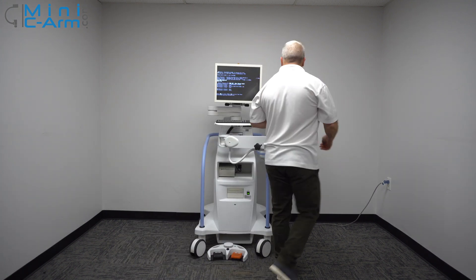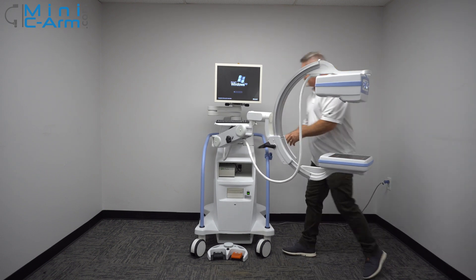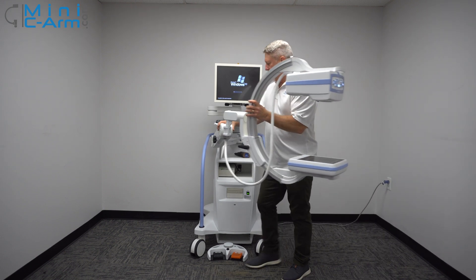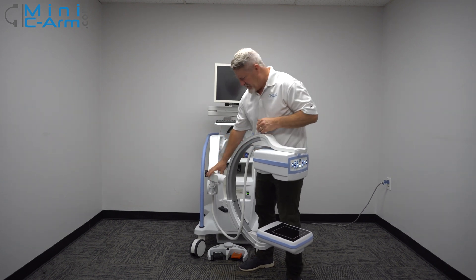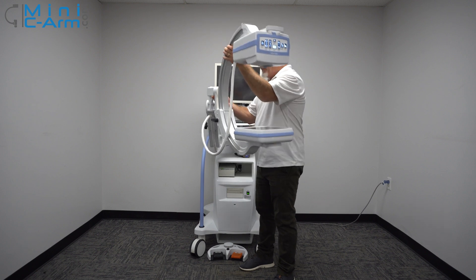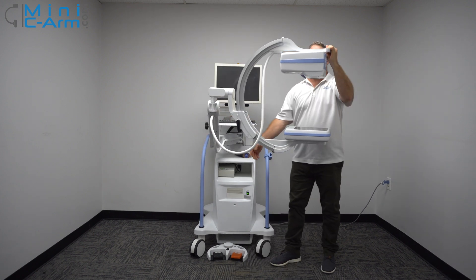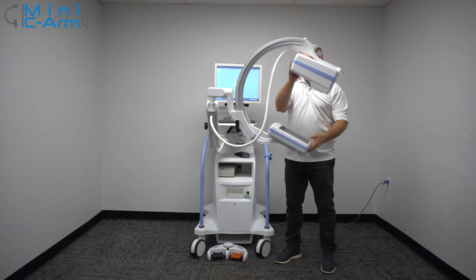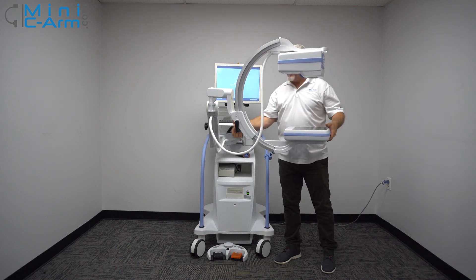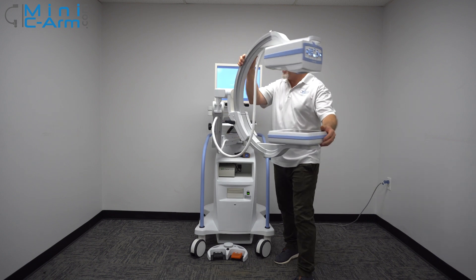While this boots up, I'll show you a little bit of the articulation of the C-Arm. That's as low as we go — it's about knee level. And that's as high as we go. You also get 120 degrees of orbital rotation. This right here is the lock, which locks it in place so it doesn't rotate when you don't want it to.